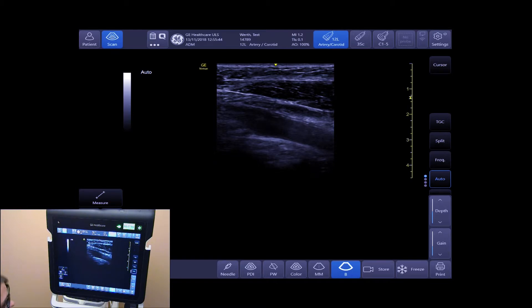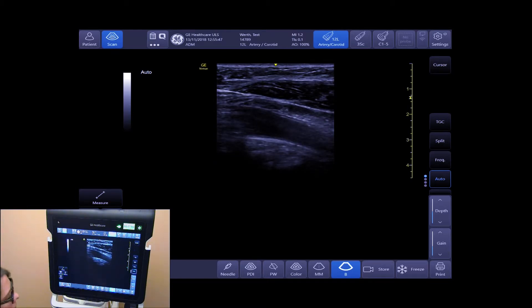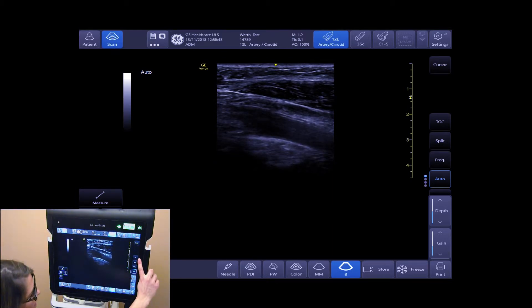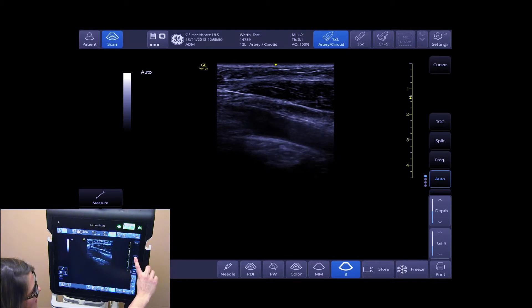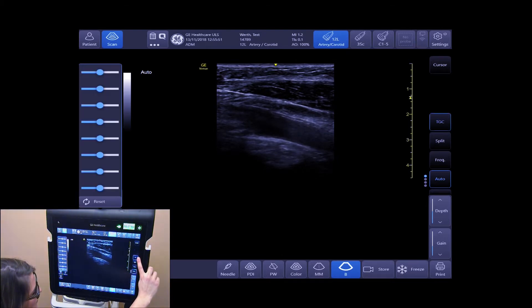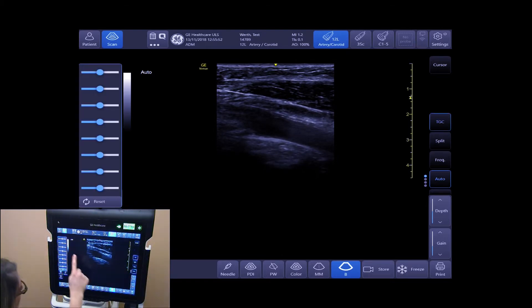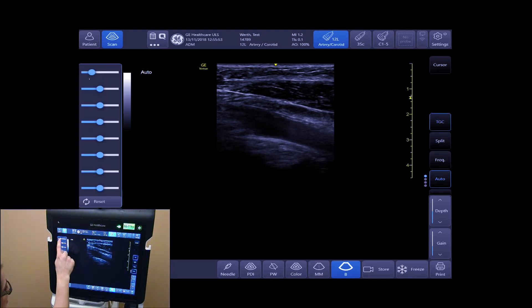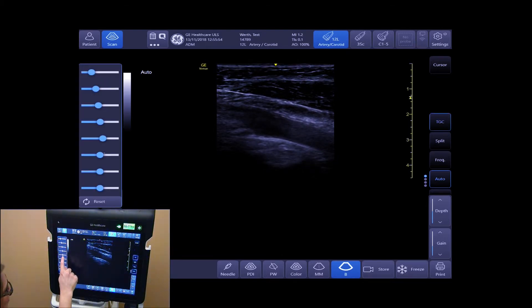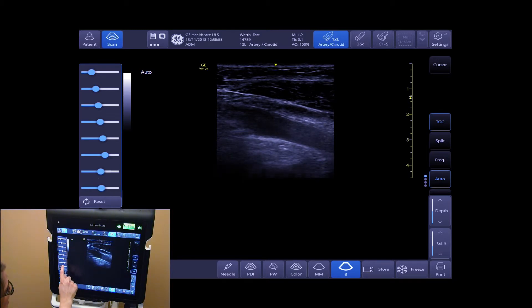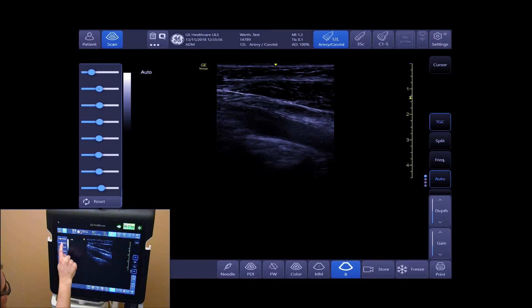To adjust your time gain compensations — your TGCs — tap on TGCs, and you can optimize your near-field and far-field image as needed.